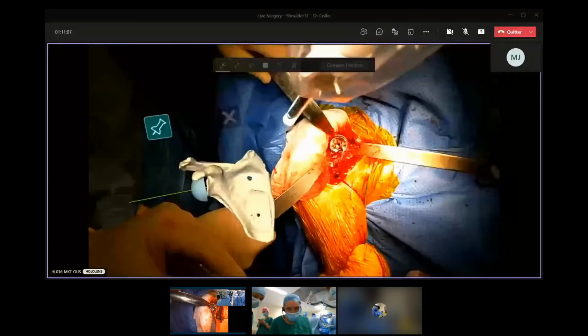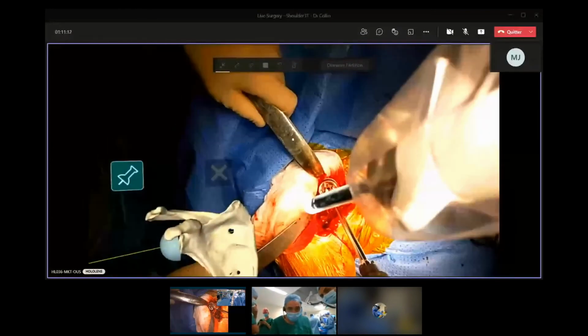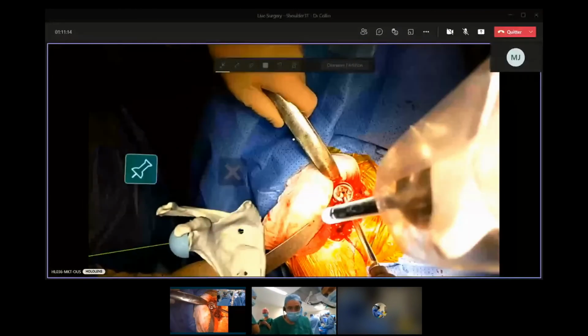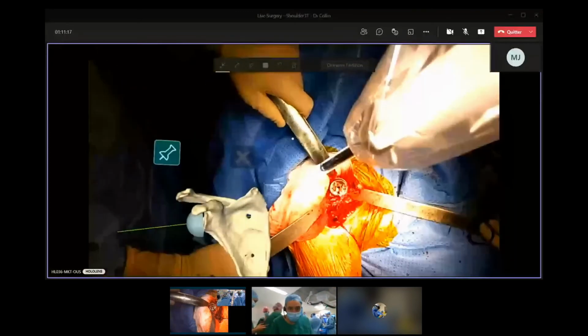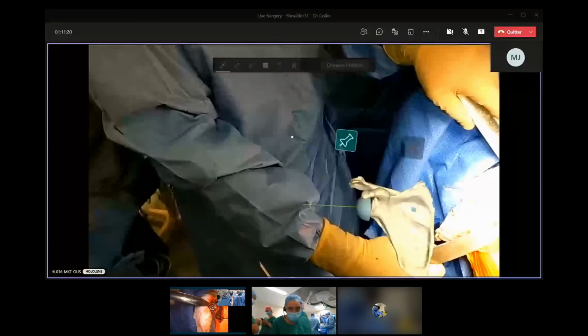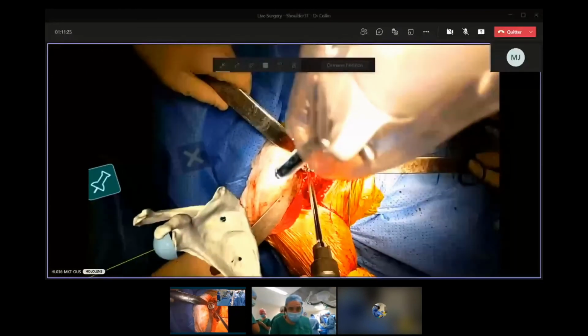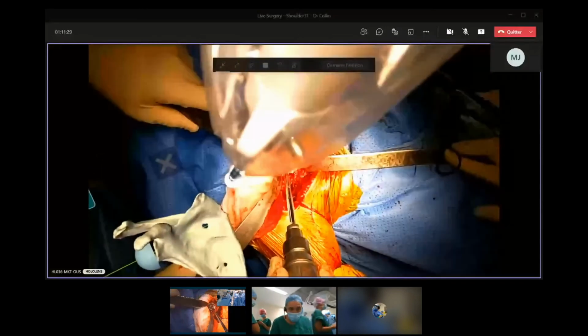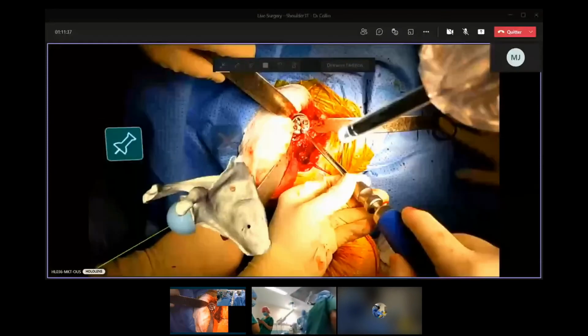So you need to be very, very gentle here. OK, by hand. We can finish here.